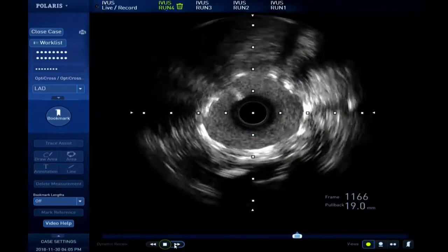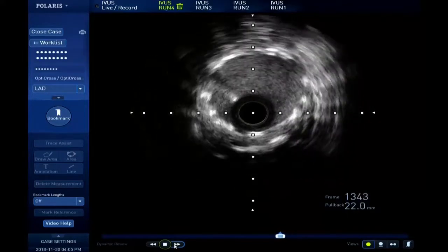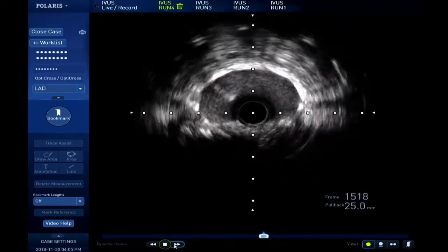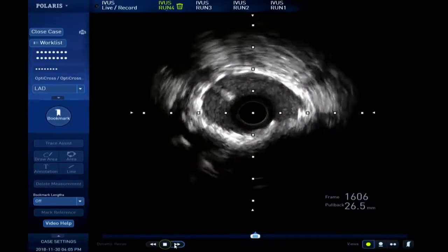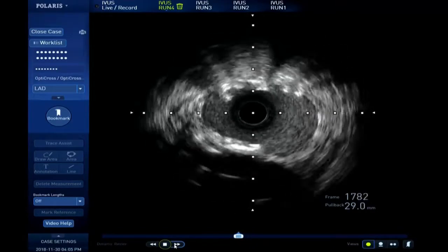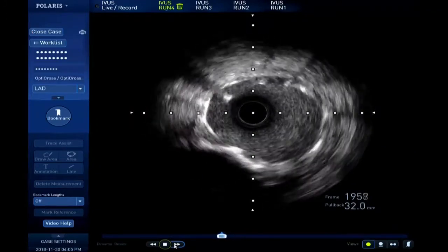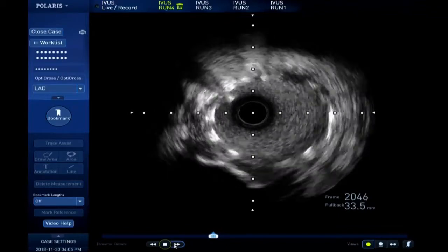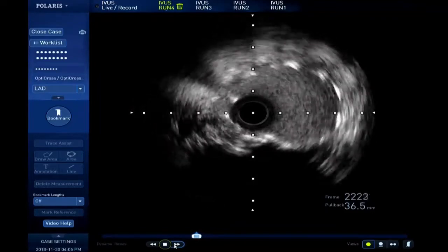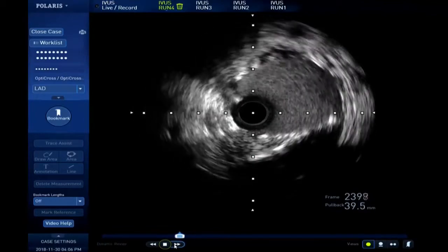Here is the aneurysmal area. 12 o'clock? Yes, 12 o'clock. And proximal to the aneurysm, some eccentric expansion, but the lumen area is more than 8 something. We will measure the lumen area. So here is the lumen area? Yes, 11, more than 12. Big enough. So here is a 4O stent implanted almost to the left main ostium.